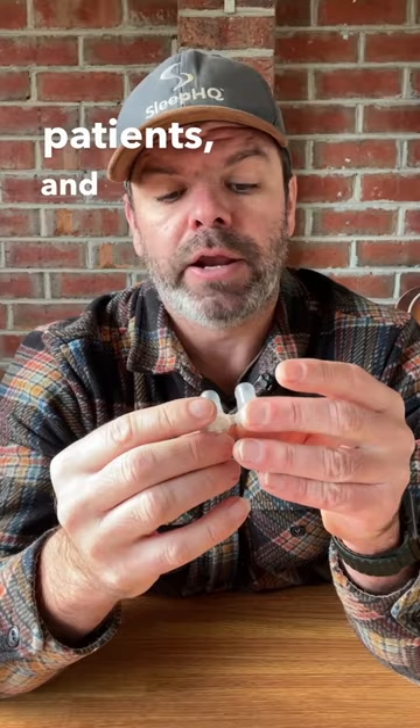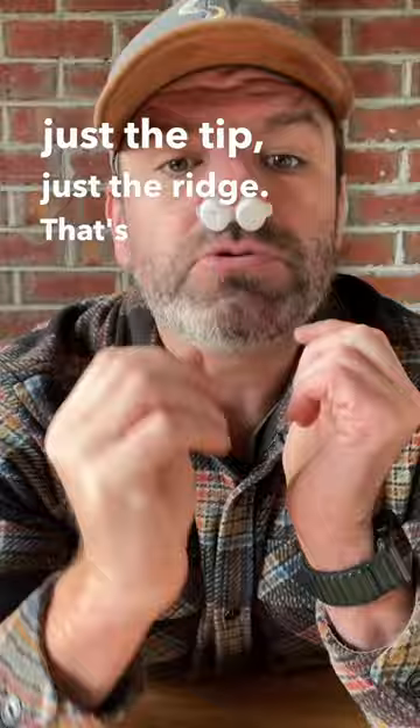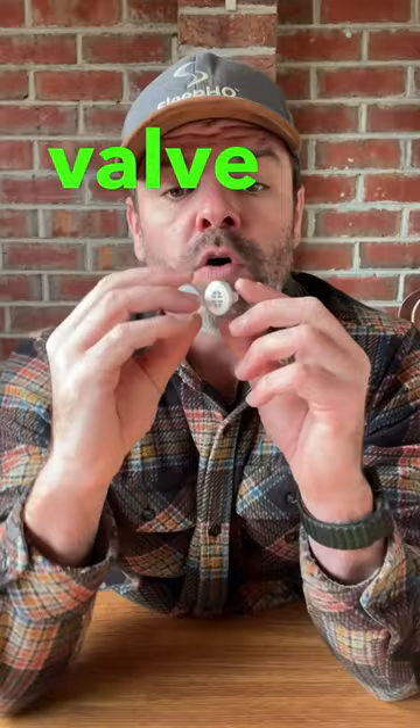Now you put it in your nose — just the tip, just the ridge. That's what she said. Now watch this. You can see that valve opening and closing, and when it closes that's what creates that back pressure.